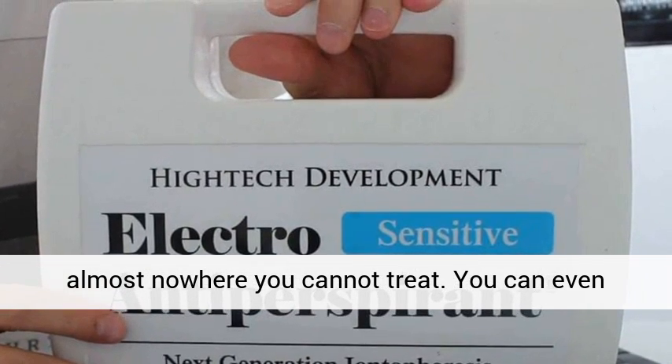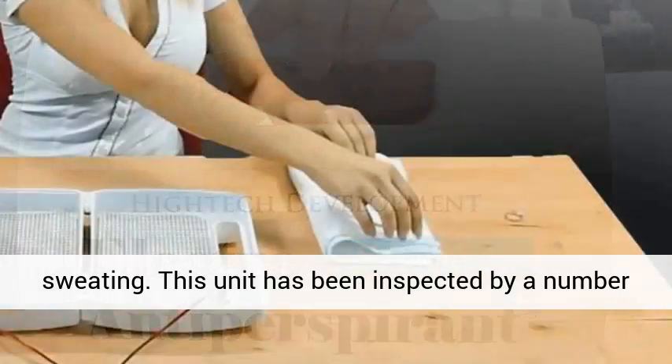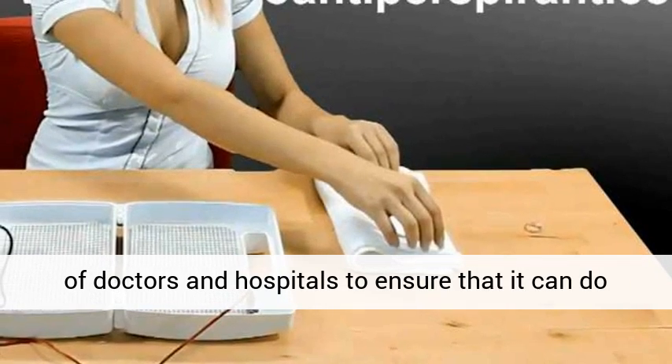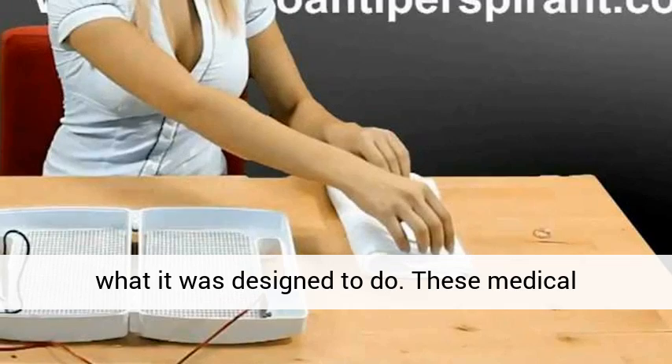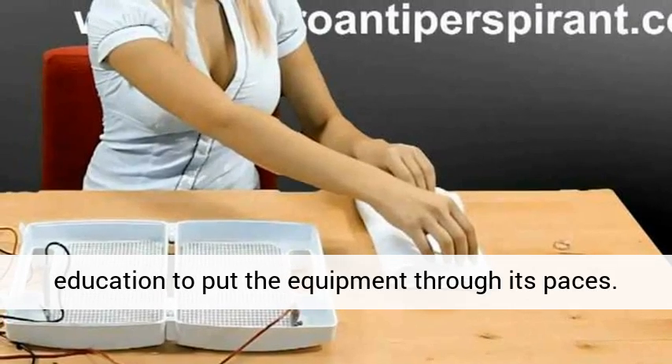You can even treat your buttocks to prevent embarrassing sweating. This unit has been inspected by a number of doctors and hospitals to ensure that it can do what it was designed to do. These medical professionals use their training, experiences, and education to put the equipment through its paces.